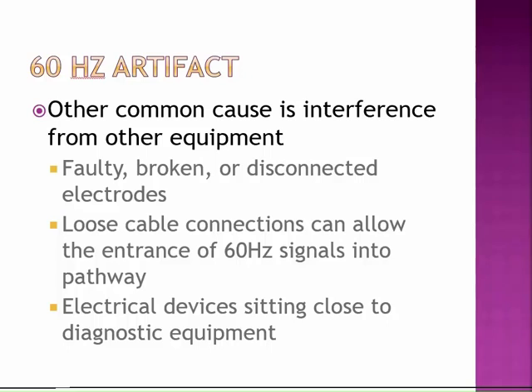Oftentimes, when you guys are in the lab practicing and I'm helping, if you're the one to set up, it's very common to just sit there on your phone, but oftentimes I can see when a message is coming in, because I can see that electrical interference coming through, and then I'll hear your phone go off that you got a message, and I can see it on the signals on the polysomnograph, which is really interesting. But all of our electrical devices can and do impact what we're trying to record. So pay attention to that.